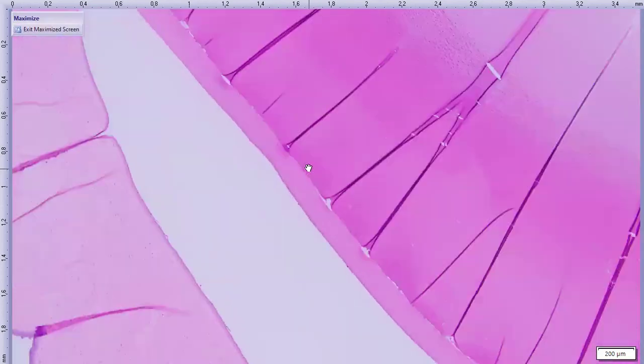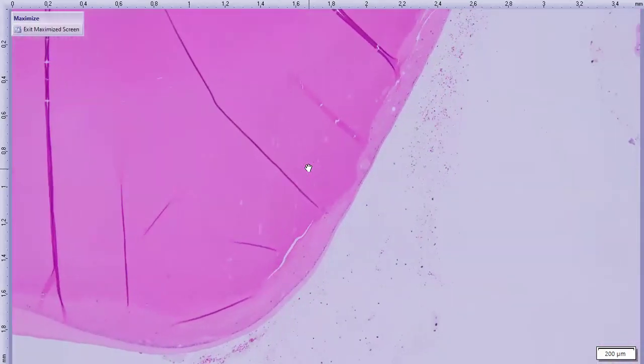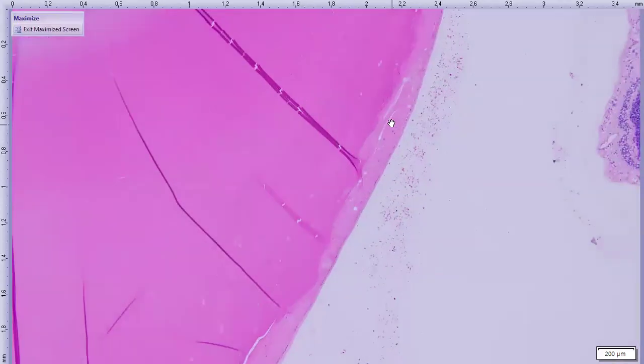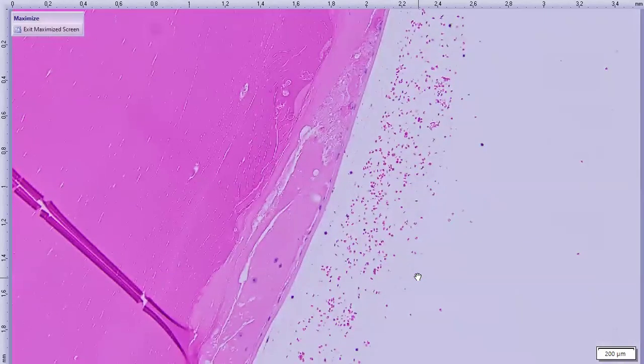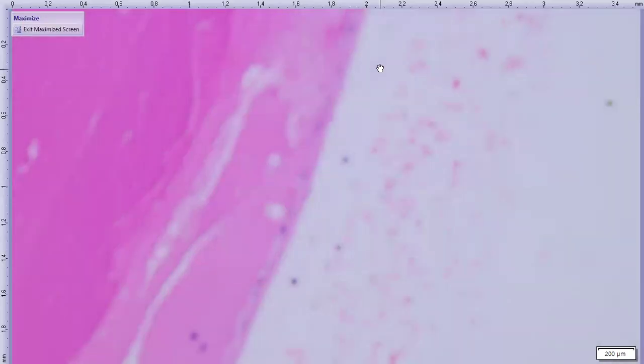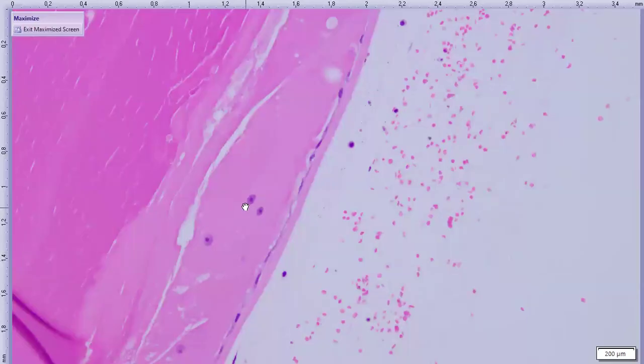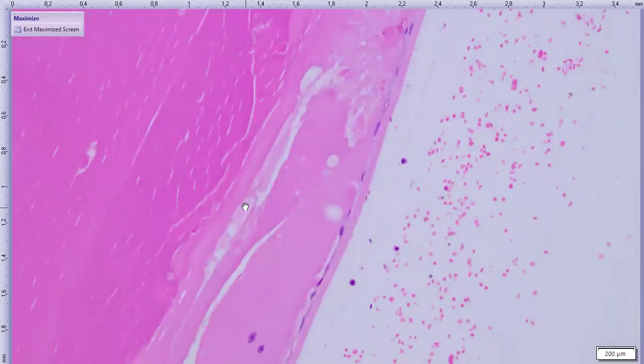And then the other big thing in this case is the lens. And if we follow our lens here, we can start to see that our lens fibers are starting to get a little bit liquefied. If we get a little even closer, we can see here's our posterior lens capsule, thin area, and we can see this posterior migration of the lens epithelium, which is the earliest stage of cataract formation, as well as our lens fiber liquefaction. We got little rounded up globules here, so our Morgagnian globules, and we have a couple that have maintained their nuclei here, so some bladder cells as well.